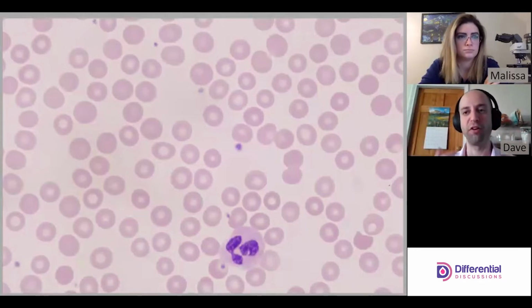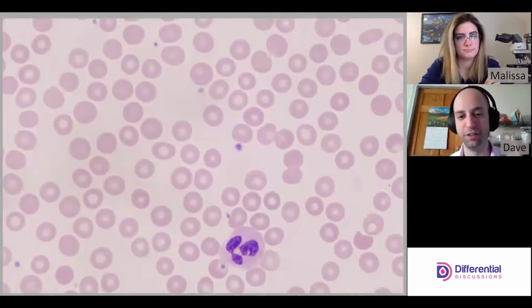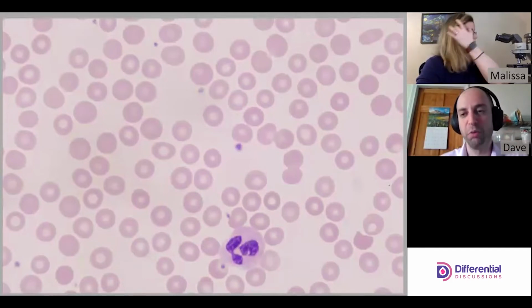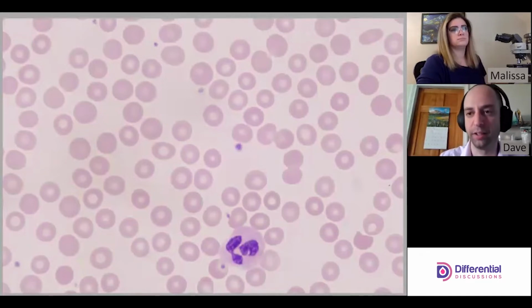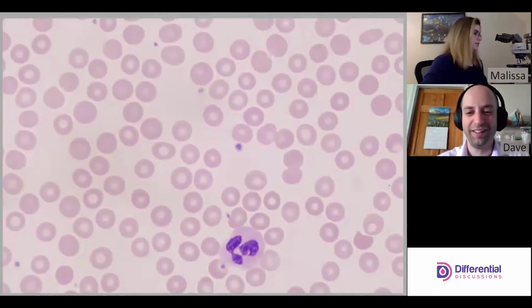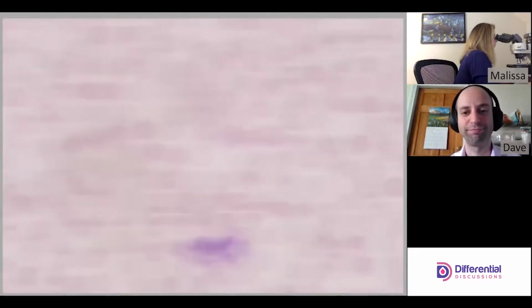The more I've already used my DNA, the more I don't need it, so I'm going to store it away, and they store it by compacting it. Neutrophils are excellent for this. Lymphs also have a really dense chromatin pattern, so you might hear us talk about that. It's pretty important. Absolutely.